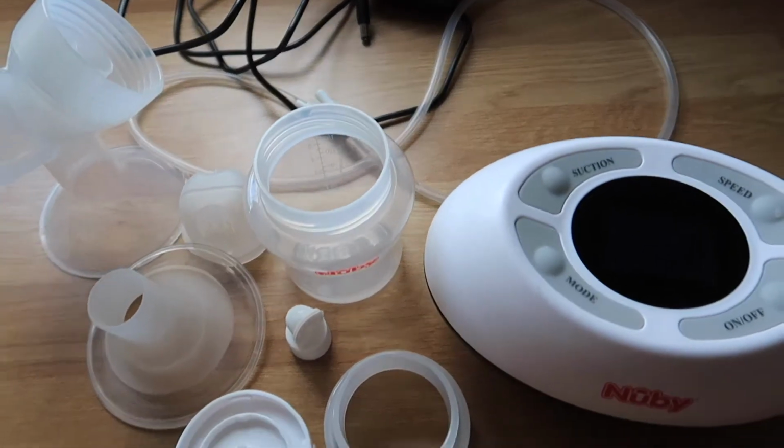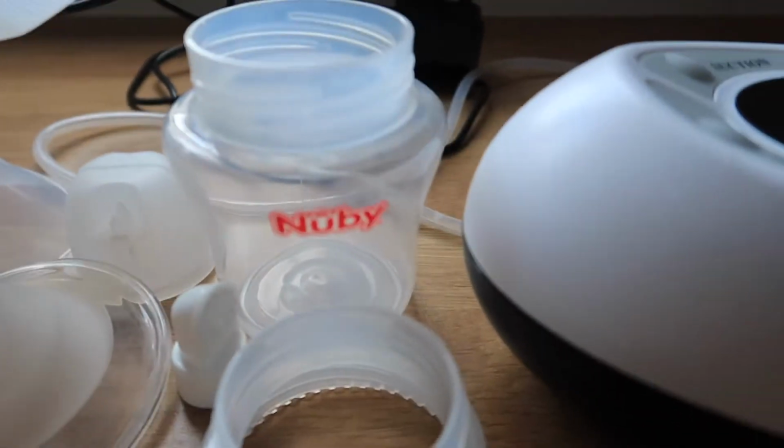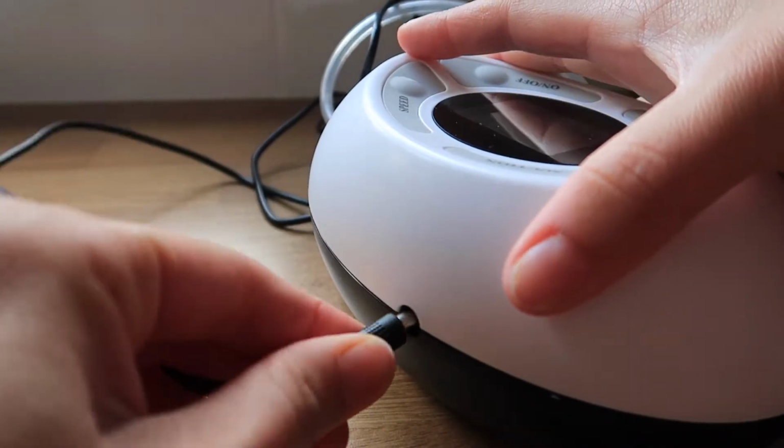There was obviously a main part of the machine, and then there's a lead, and then obviously a lead to the power source. And because there's all these components to it, you're definitely restricted in your movements. You've sort of got to stay in one place if you're pumping through an electric pump, and I did not like that at all about it.